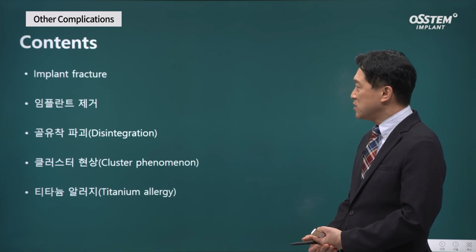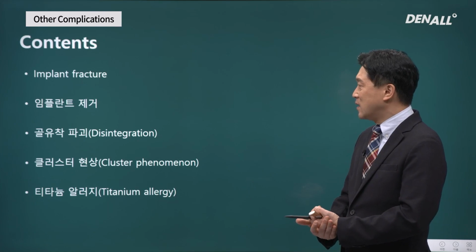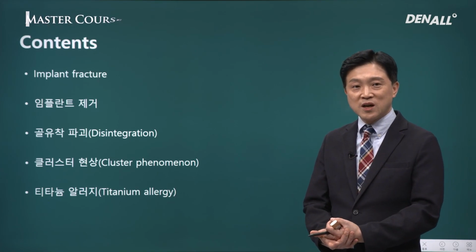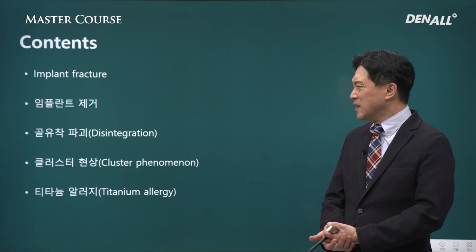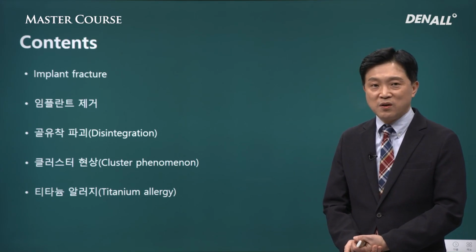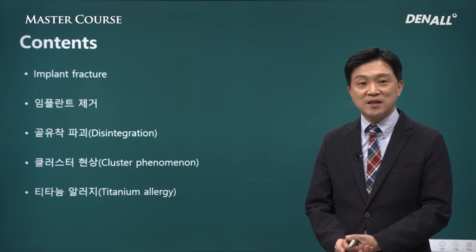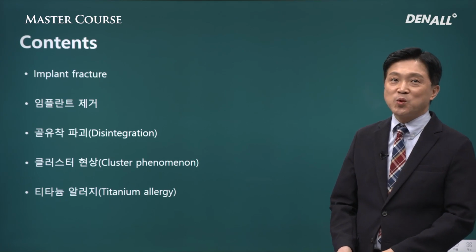There can be implant fracture. In that case, implant removal will be required. There can also be disintegration. And albeit less frequently, there can be cluster phenomenon. And the patient may have allergy to titanium. I want to address them briefly.